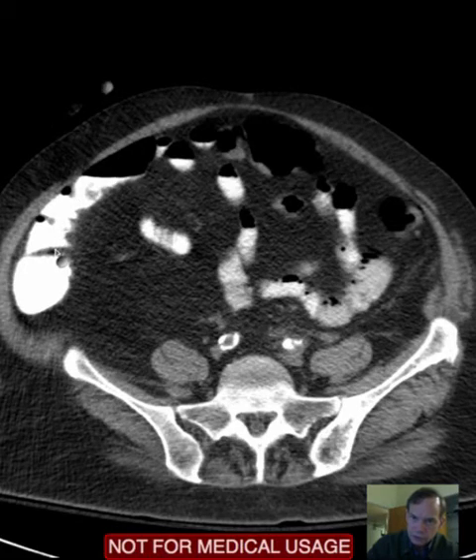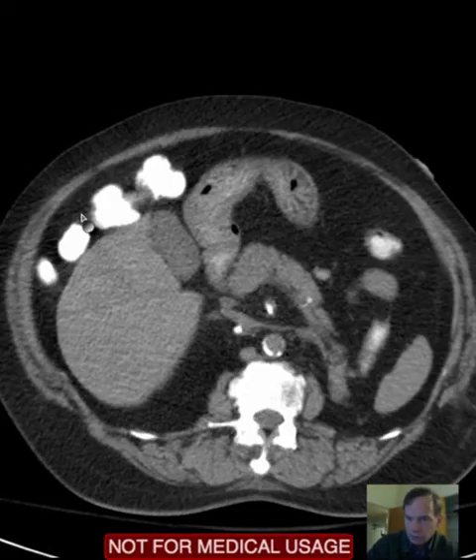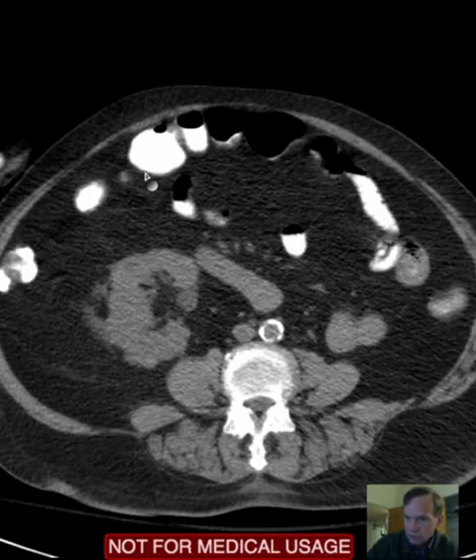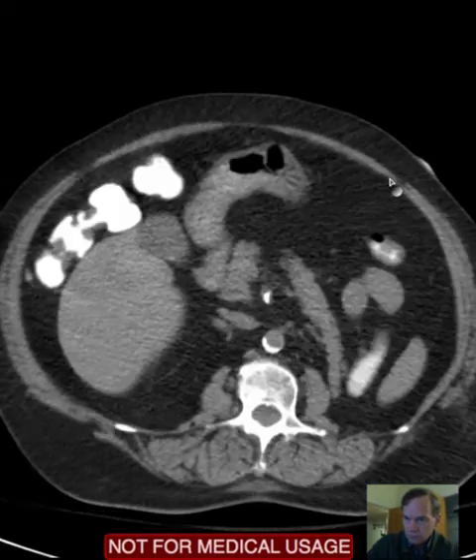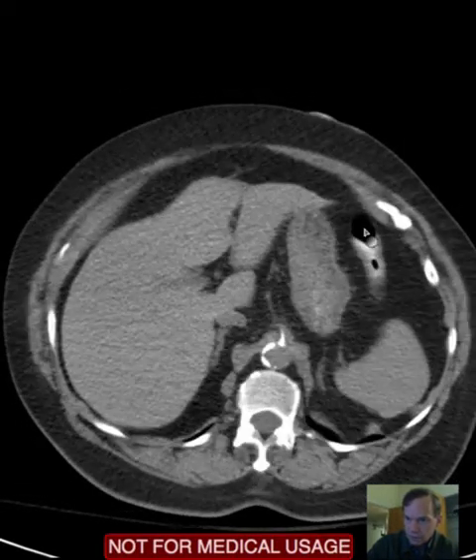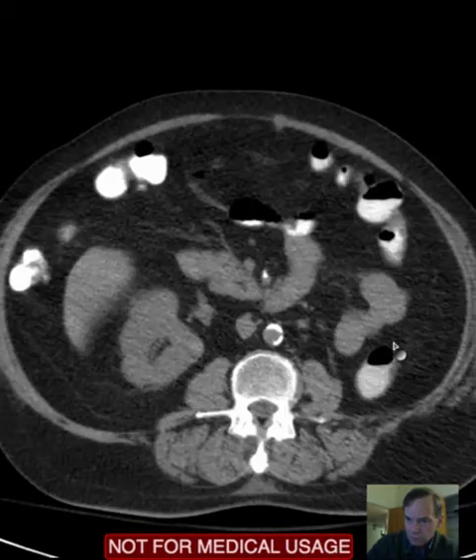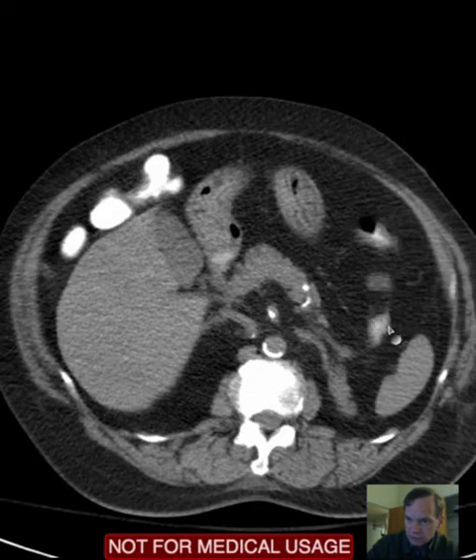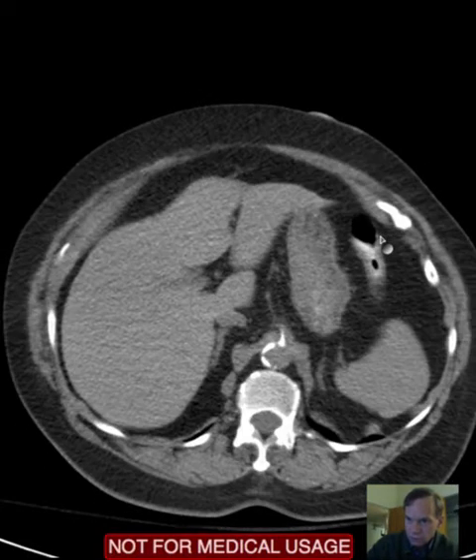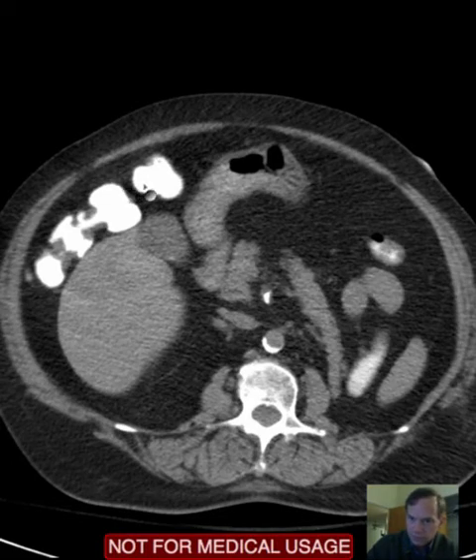The cecum then courses more superiorly into the right colon, and the right colon courses across the upper abdomen as the transverse colon. Here we have the splenic flexure — here's the spleen. As you follow this, this is colon — so this is the splenic flexure of the colon. The hepatic flexure would be right here; in this case it's immediately adjacent to the liver.